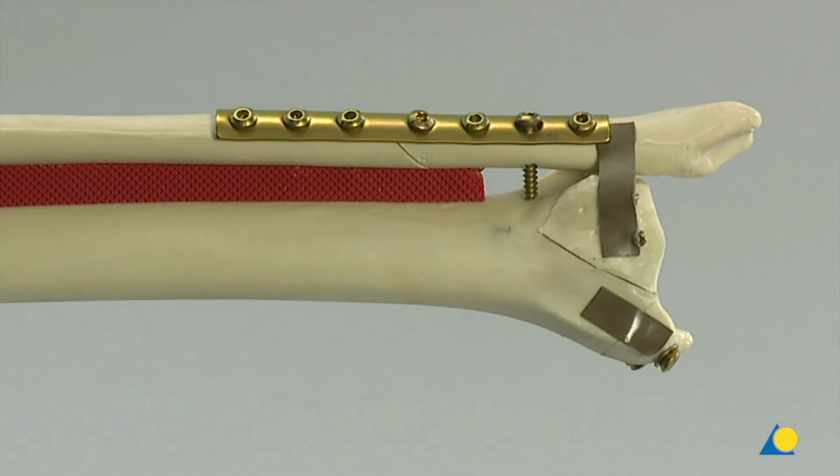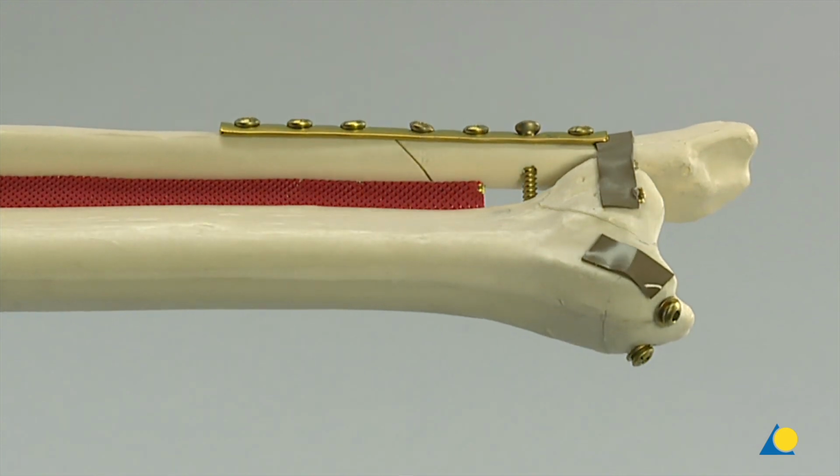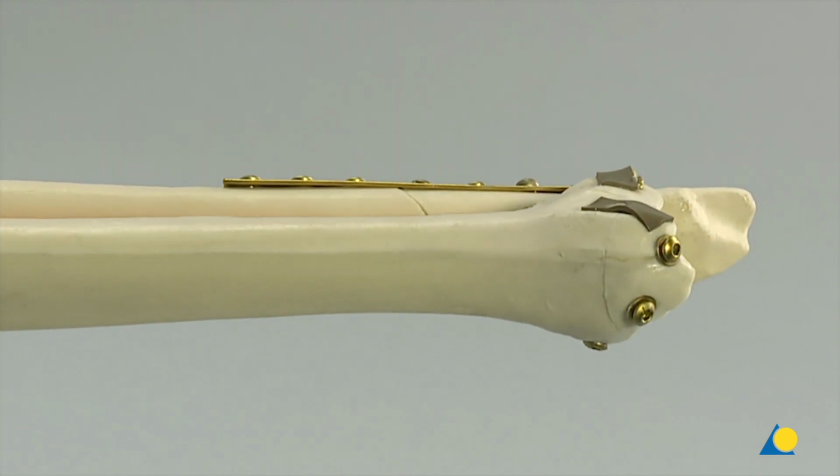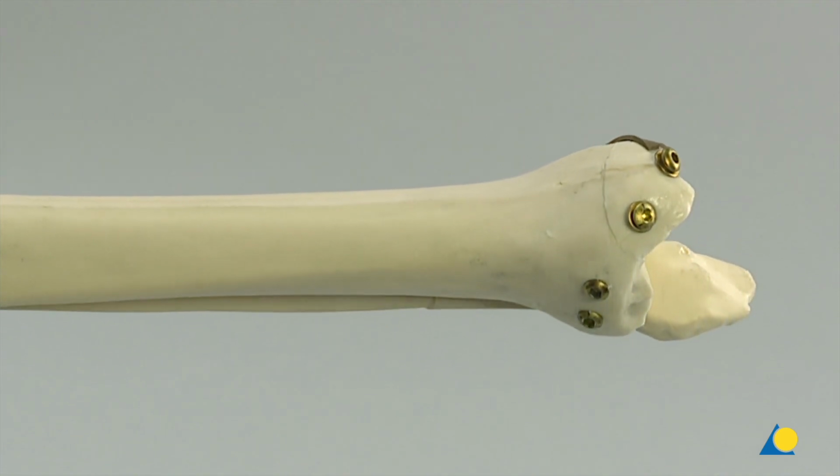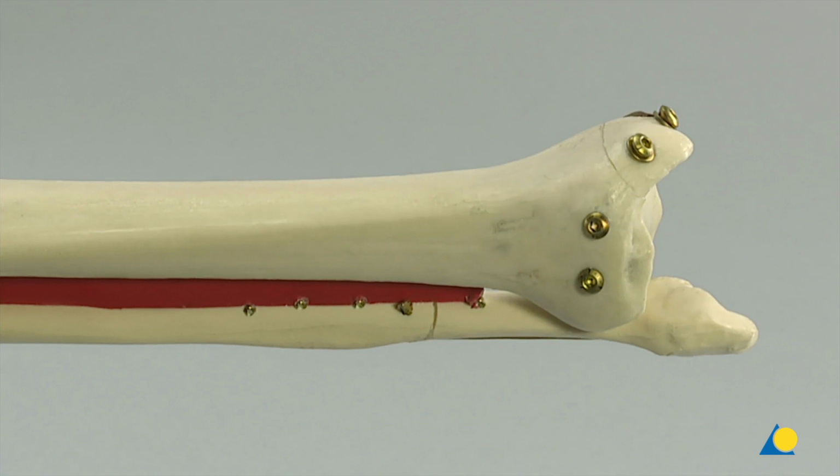Here we can see the positioning screw parallel to the joint, the lag screw fixation at the medial malleolus, and the posterior malleolar fragment with screws inserted from anterior.